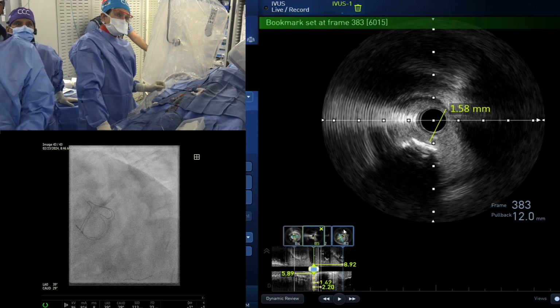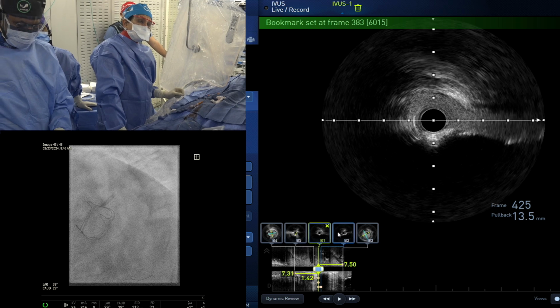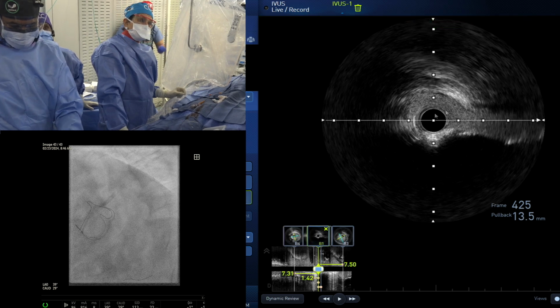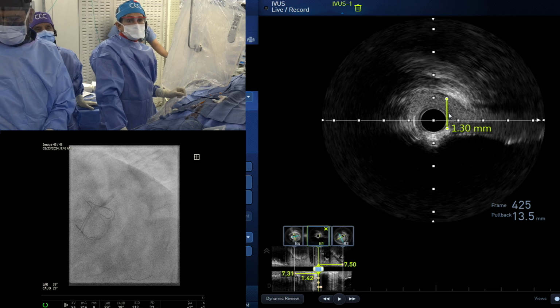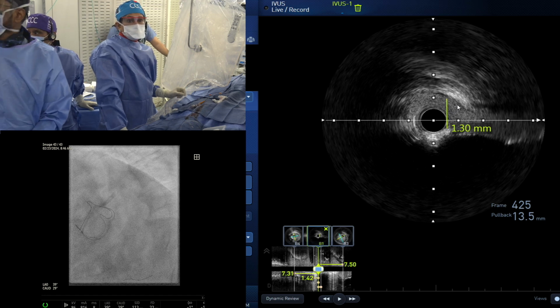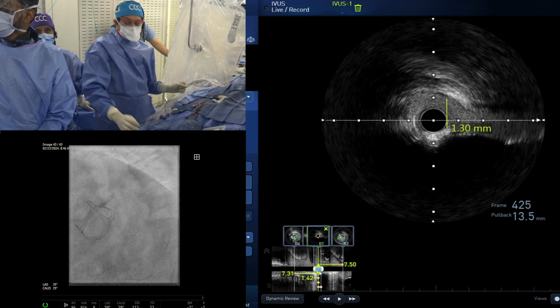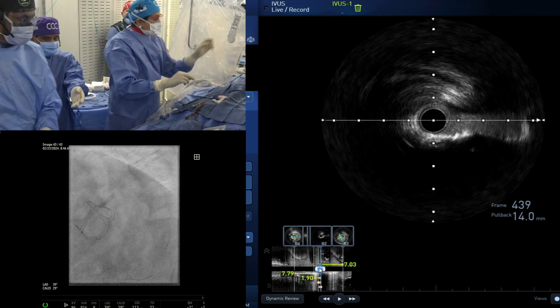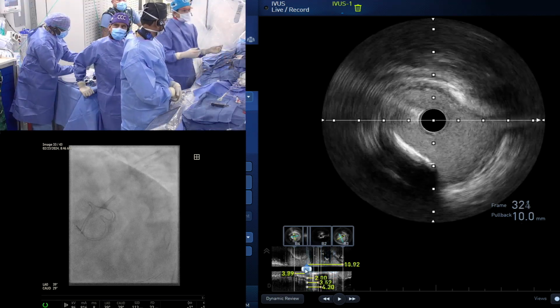Yeah, but the issue is the distal left main. It's true, the IVUS passed, but the distal left main is so tight. The MLD is going to be like 1.3. This is the distal left main, the minimum lumen diameter. Okay, very good point. Everybody talks about the lumen: let's go 1.5 burr. No, we have to make a point, because they keep talking: go bigger burr, bigger burr. No. But the question is always no.